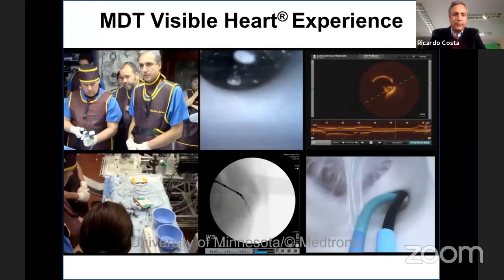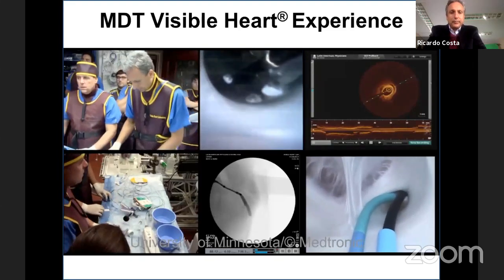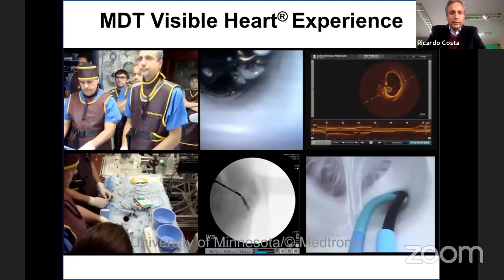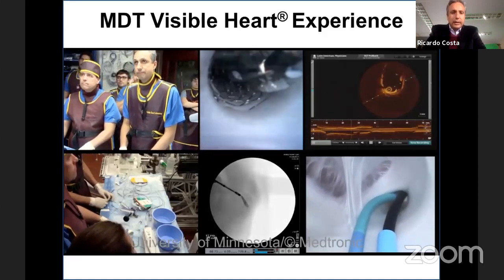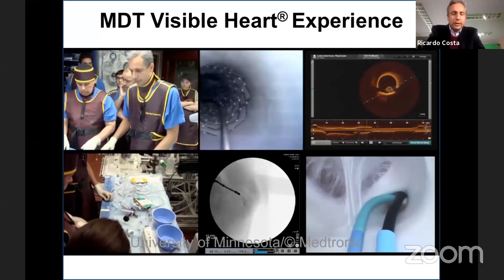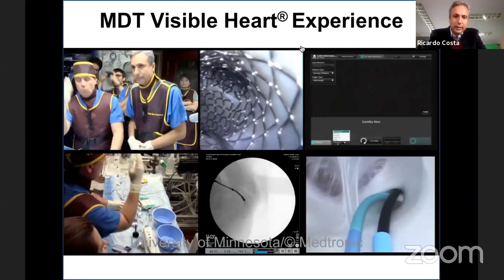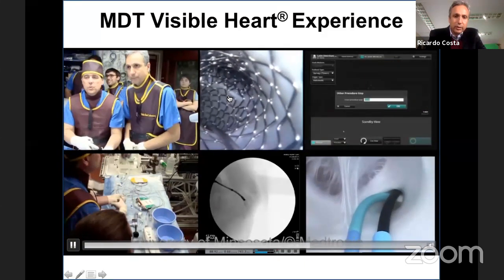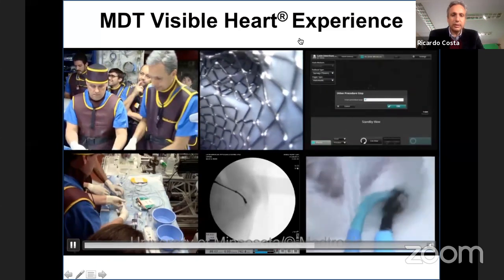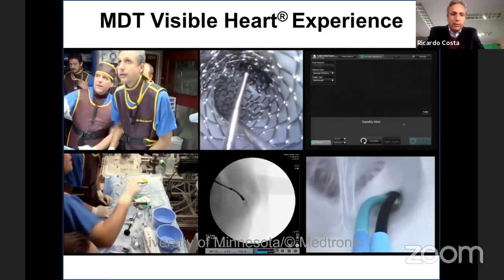Here, we have stenting now the main vessel. So stenting was easy. Crossing with the stent was easy. After we do that, you're not going to see the type of distortions that you used to see in the old days. And see here, the ostium, even though it's a jailed ostium, the new ostium is already there. And that's how you facilitate recross.